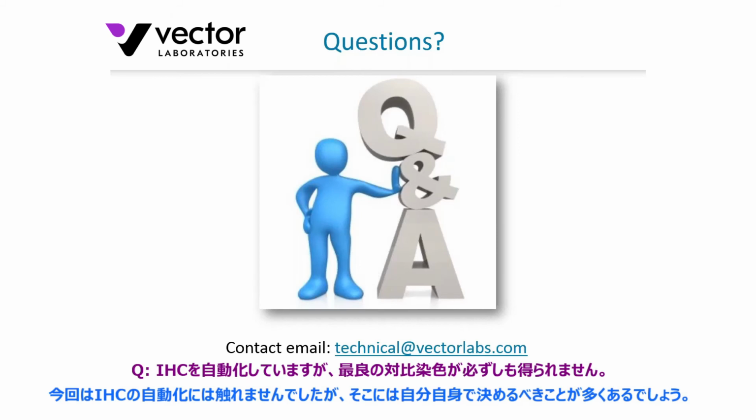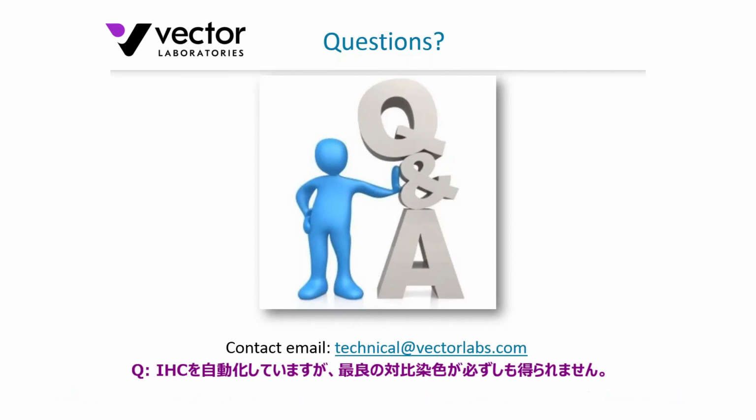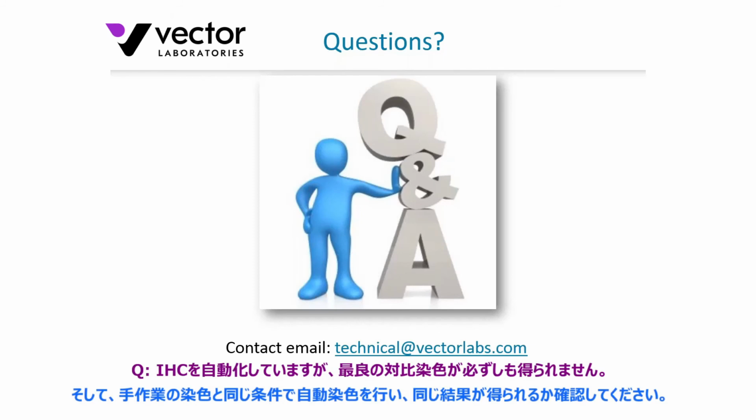Certainly that may be particular to, well, things you can determine at your end. Maybe run it manually initially on a couple of different tissue sections just to gauge the parameters, as we mentioned, things such as time, whether or not a differentiator is required, or indeed the actual formulation of the counterstain you're using. Make sure it might be one I'd recommend, as with an aqueous-based media, maybe just run it manually and then see if you can get those same parameters set up on the automated stainer.